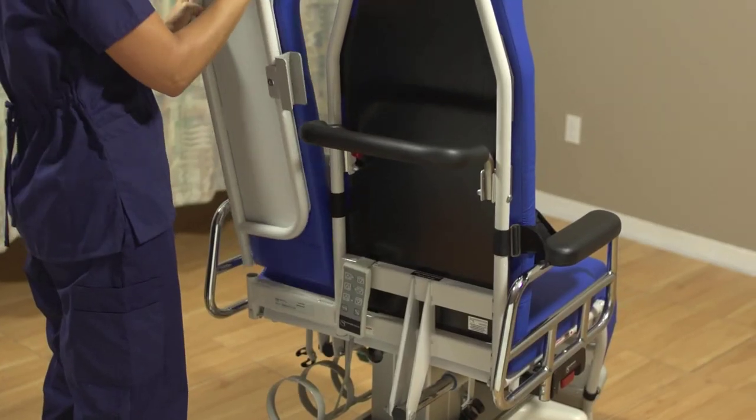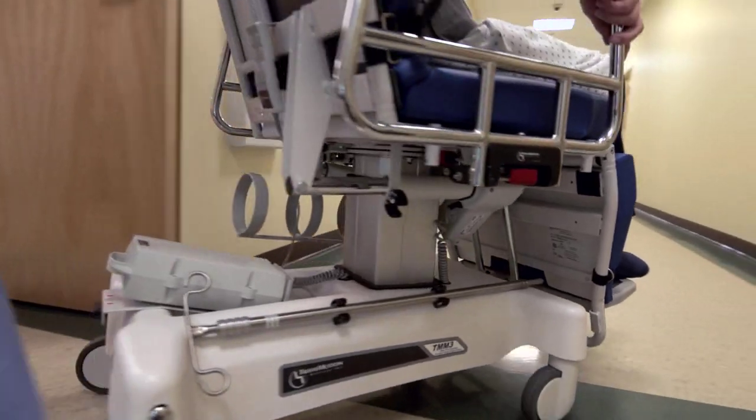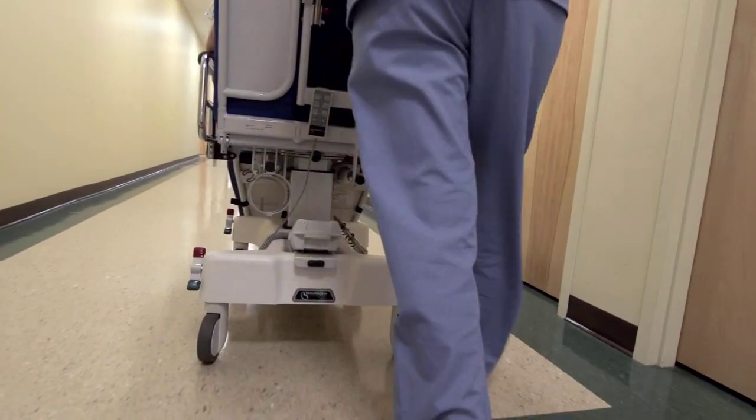To transport the patient to and from the swallow study, you'll need to convert the narrow back into a full-width chair. Simply attach the back extension accessory in place. This extension is essential for safe patient transport.